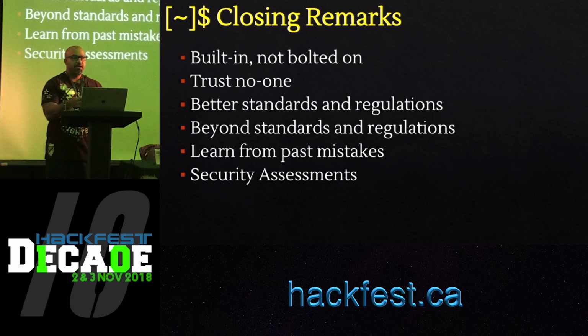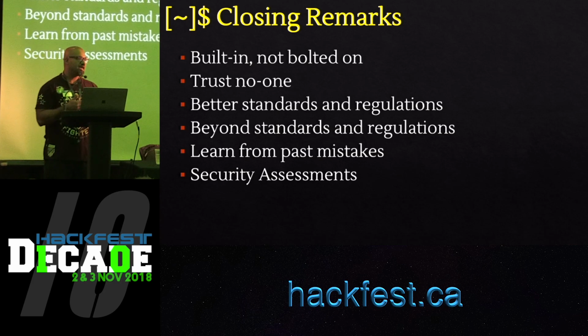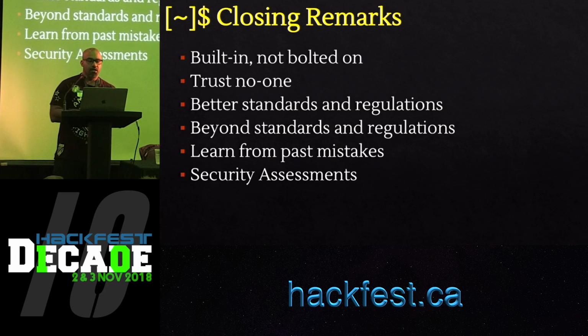It's hard to trust devices. So it's hard to differentiate between legitimate medical devices and malicious or compromised medical devices. So that's another problem because network segmentation is going to be a problem. I think the FDA has started to do a lot in terms of betterment of standards and regulations and defining requirements for device manufacturers. But again, we've seen time and again that getting compliant or just adhering to regulations isn't going to do it. So we need to go beyond that.